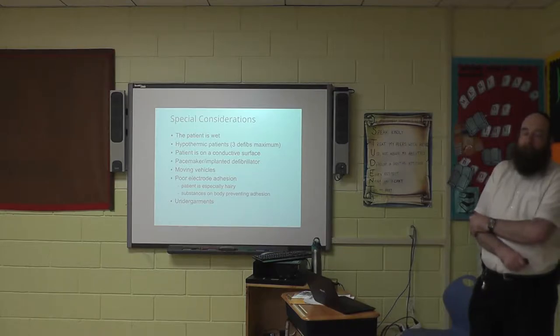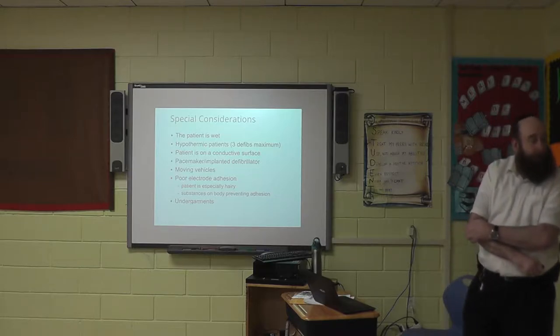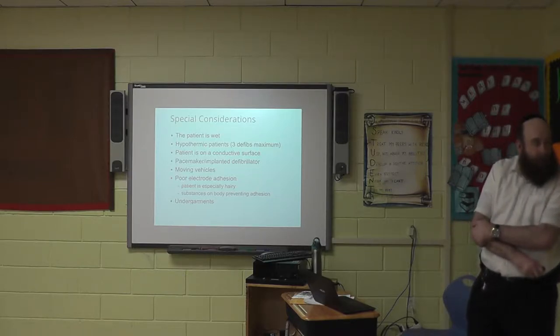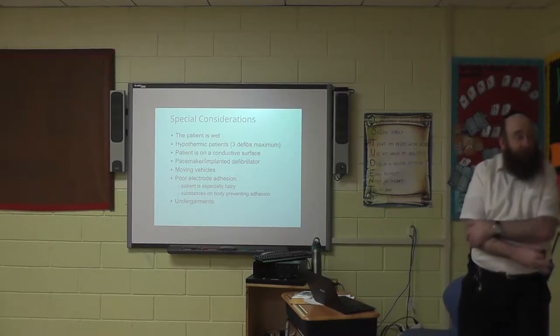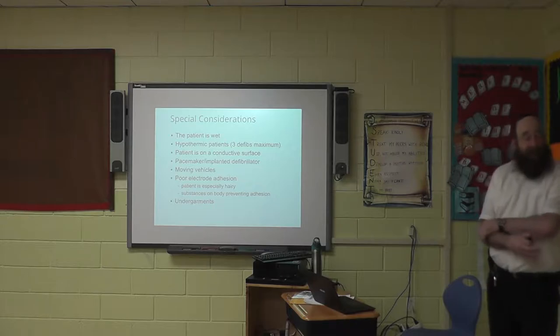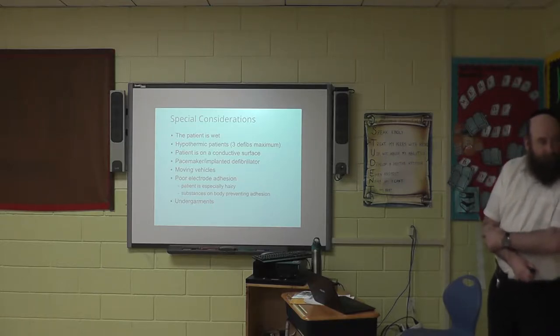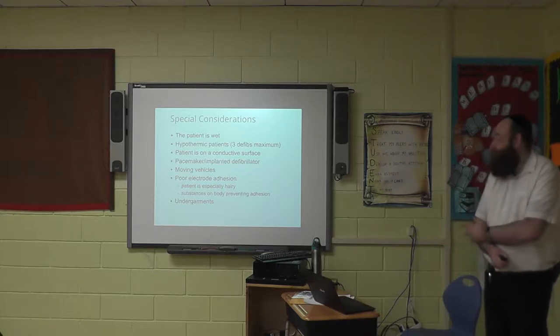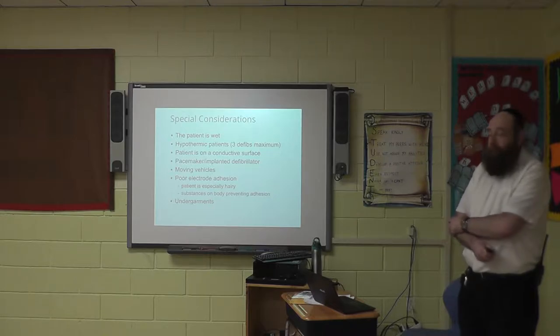Does the AED make a problem for the pacemaker? As long as you're not on top of it. You're better off getting some sort of towel or blanket underneath them. Even that will go through if it's strong enough. The pacemaker's broken. That's why they went into arrest. Otherwise, the pacemaker's not supposed to check.